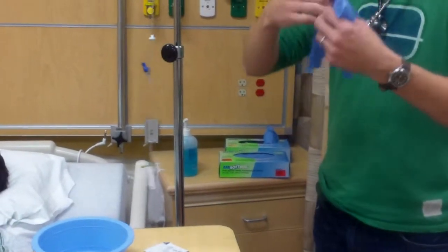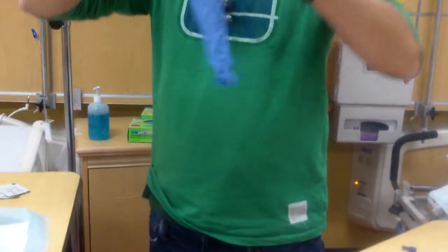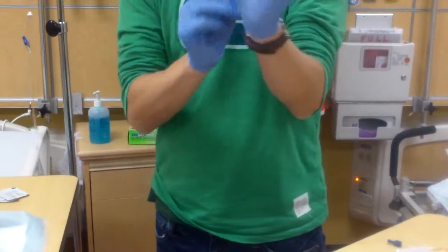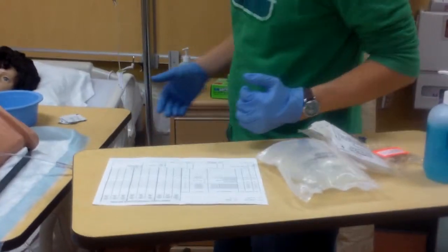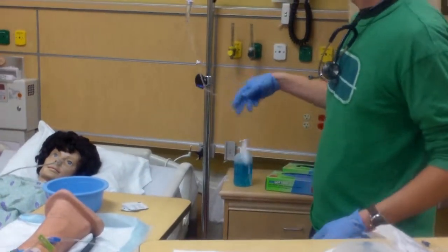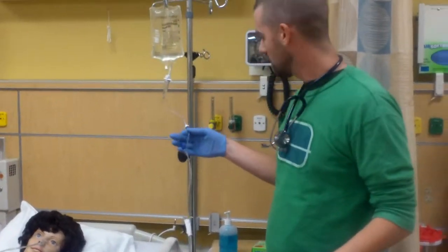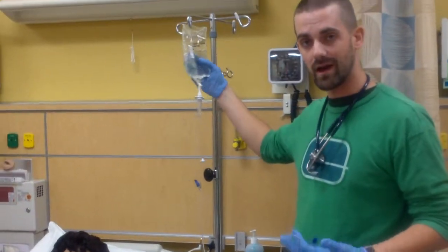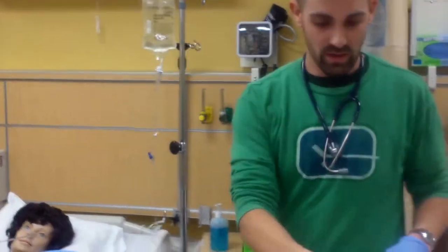Okay. On my gloves. Okay. So once I do that, I've traced the tubing. It's also important to note that there should be an expiration tag on the tubing. So then we know when to change that as well. But for the video, it only says changing the mainline IV bag, so that's what I'm going to do here. So I did that. So let's get some supplies set up.